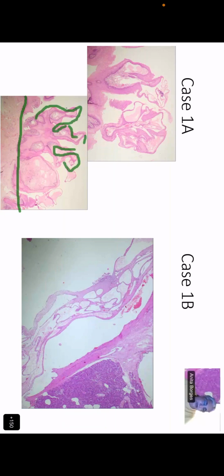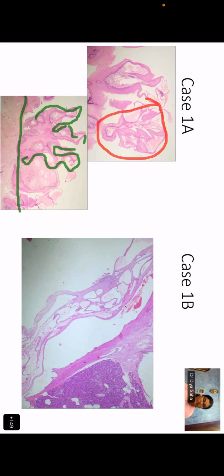Okay. Do you think that those are finger-like projections that reach the surface? Are they only finger-like projections, or are there some other projections that are not finger-like? Everything is finger-like? Not everything, ma'am. This thing is finger-like? No, ma'am. That one is good. So now, what kind of papilla are you going to call that? What sort of papilla are you going to call it?